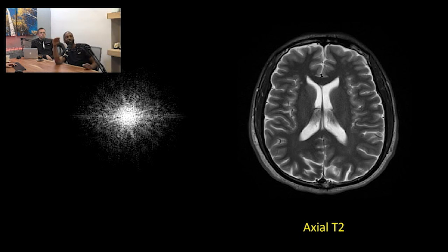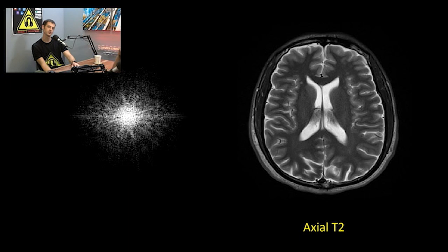Like that should be exactly how the image comes out. But technically, each point is a data point, and each data point represents a point on the image, but it's not actually one-to-one, right? Right. You're right. If you change a single pixel in the Kspace a lot, it will affect the entire image. We'll see some good examples of that in a little bit.